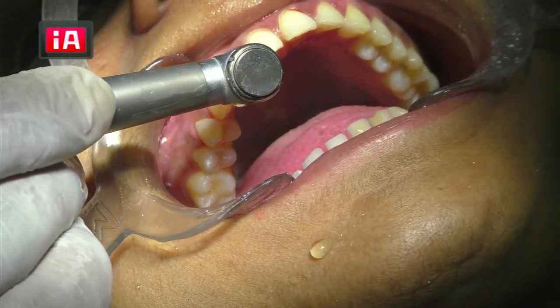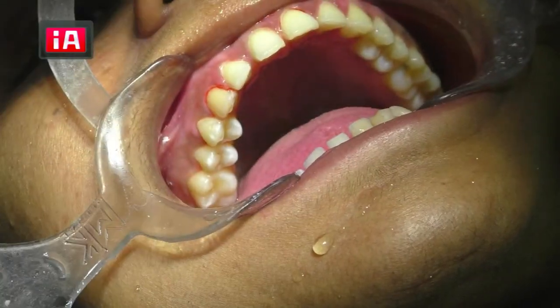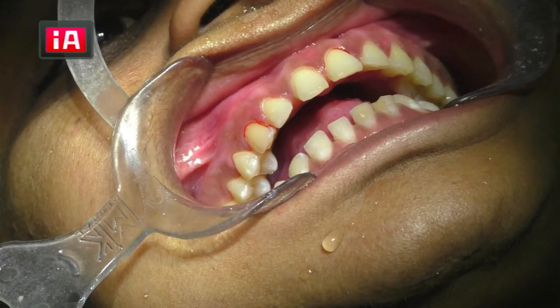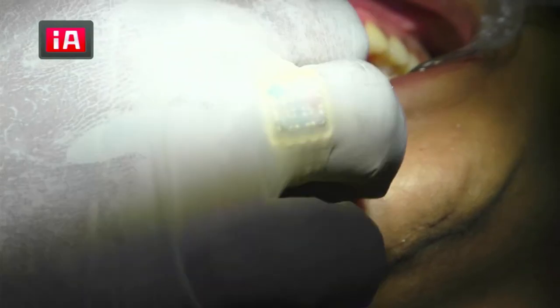It will be more appreciable when you do a scan. So we're going to scan it out. We have a digital scanner. For a more precise impression, we'll take a digital impression using a scanner.